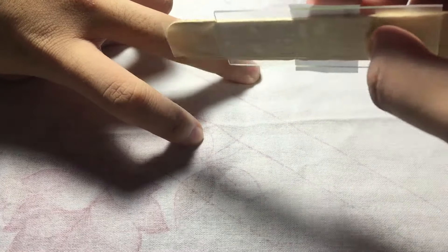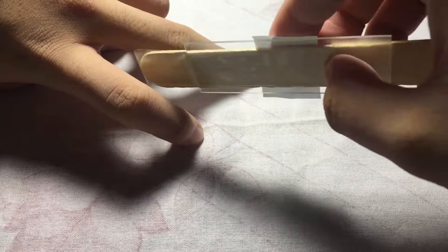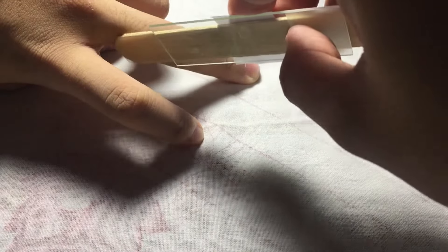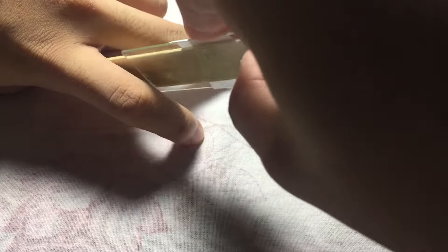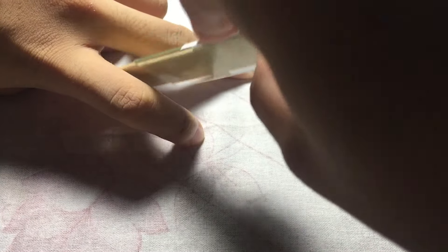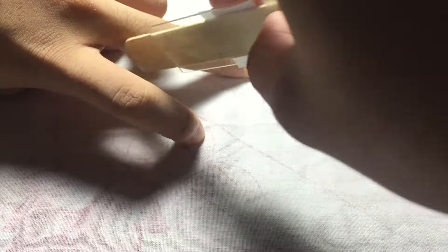Do not insert inside the anus - do not insert. Stay on the perianal region, on the sides. So the sticky end, you press it lightly.